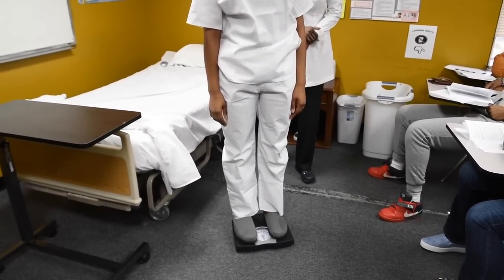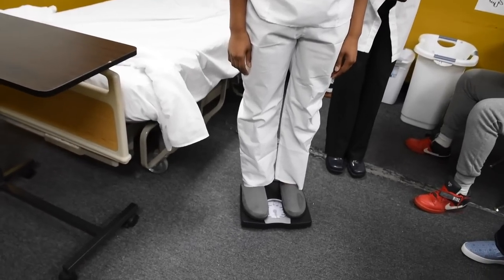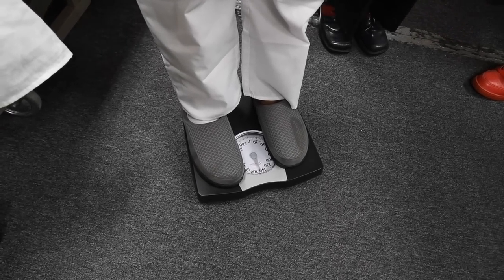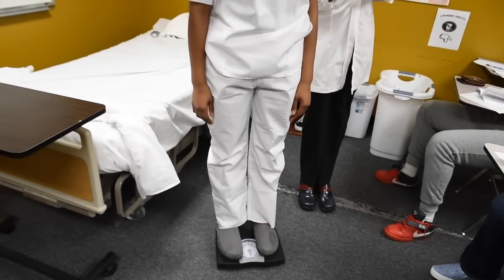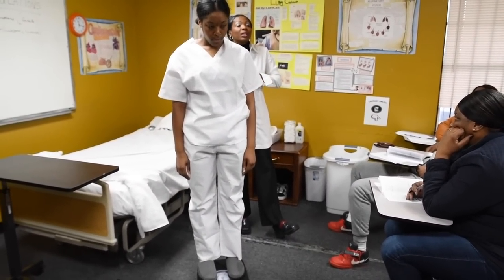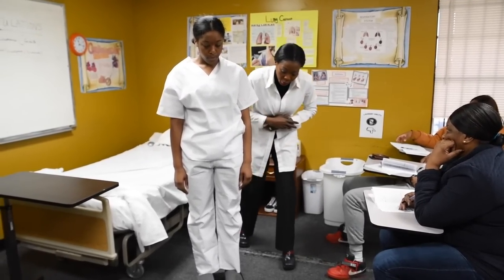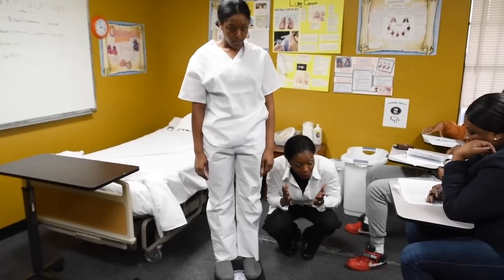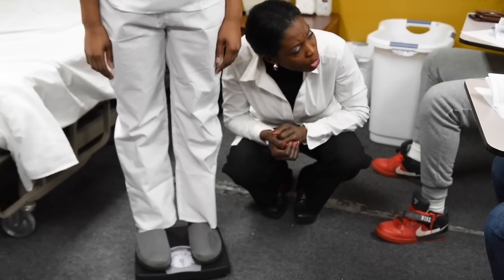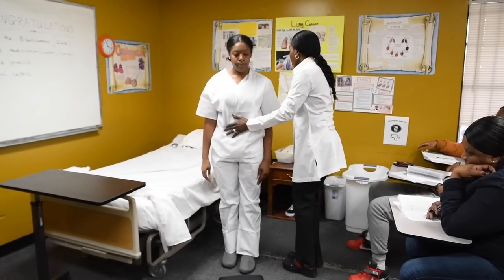The examiner is also going to come from her seat or his seat. Some of the examiners are male. And they watch or look at the scale with you. So I'm going to squat here. Do not bend here. Remember, you have only 2 pounds as a margin of error. If you do not squat so you can see clearly what your client's weight is, do we have a problem? Yes, if it's off, unfortunately, we will not make it. So you squat, even if we have knee problems, you have to bend down over here. And then I keep the results in my mind. Help my patient off the scale. We're going to walk back to the bed.